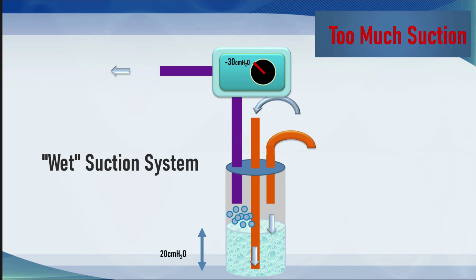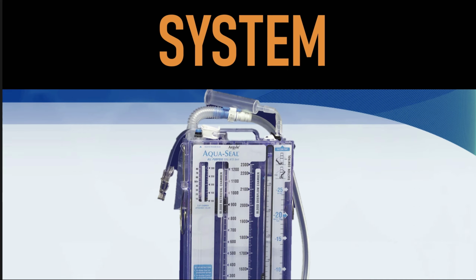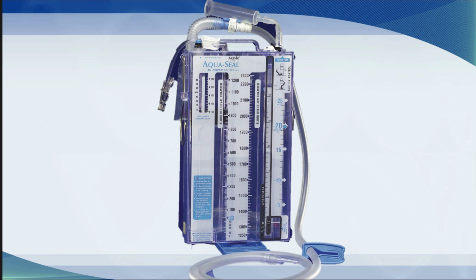Now you may say, I have never seen this 3-bottle system. And you probably haven't, because nobody has done it this way for decades. Instead, you'd have seen something like this. To understand this, you need to understand the 3-bottle system. This is a relatively modern chest draining system that incorporates the 3 bottles in one place.